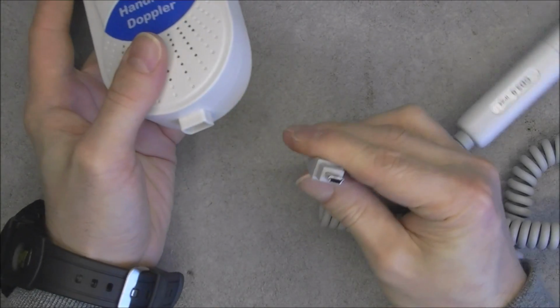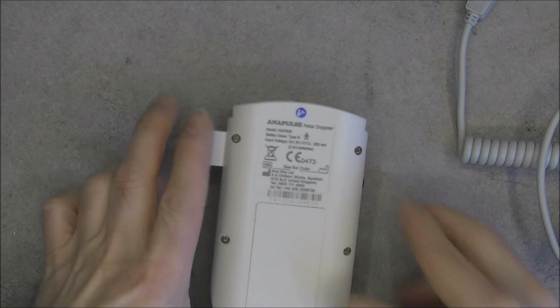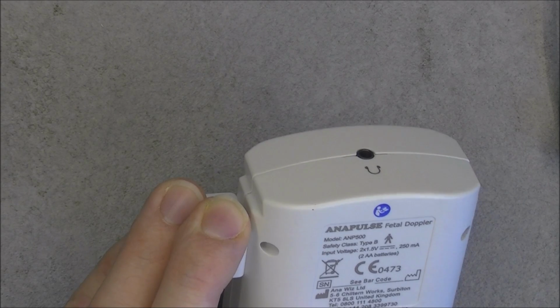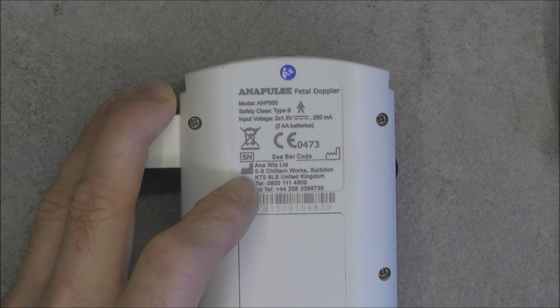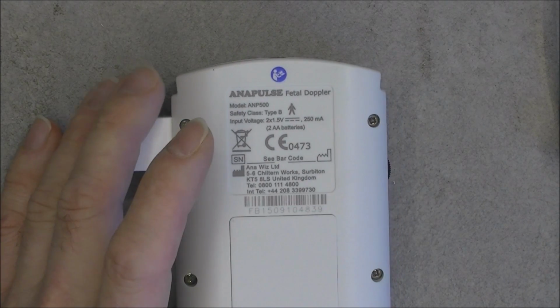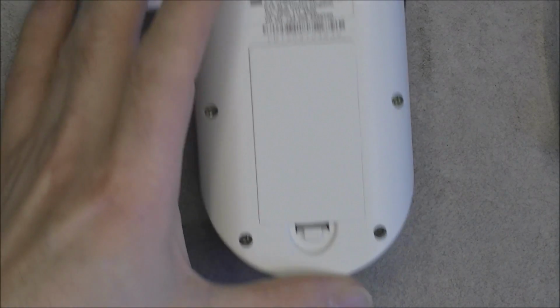First, this probe is connected with some kind of mini USB plug, but it is probably not USB. On the back you have a quite comprehensive information sticker. Well, it is laser engraved, it seems, on the plastic, or silk screen printed. Like most medical equipment, you have regulatory information. In the user manual they say this device has a shelf life of 5 years and should be replaced after 5 years. Not sure why. It seems it is not very old, maybe from 2015.